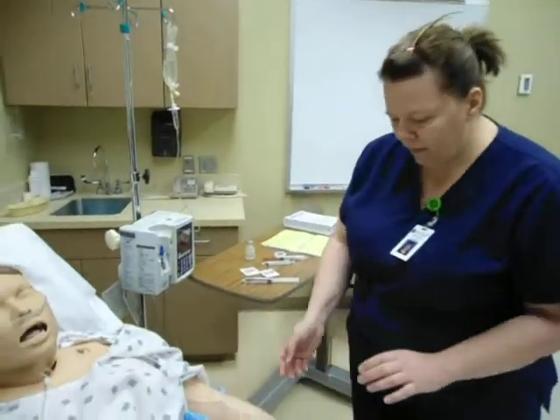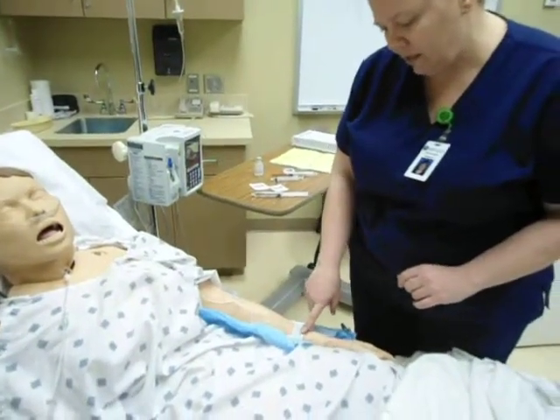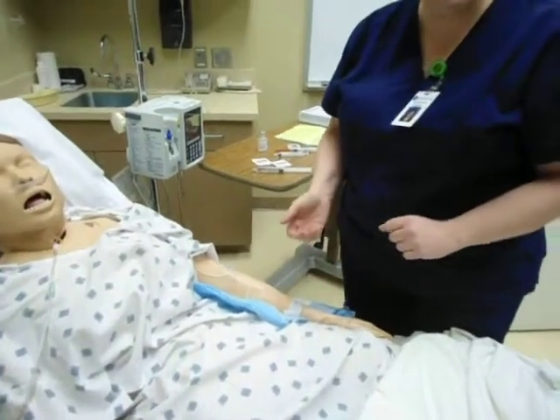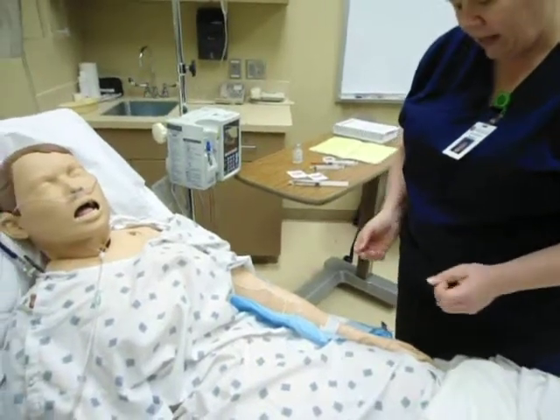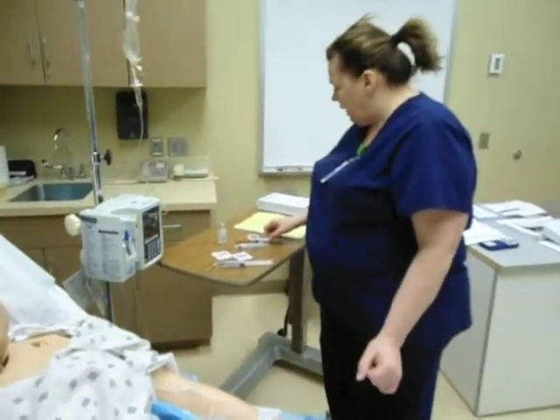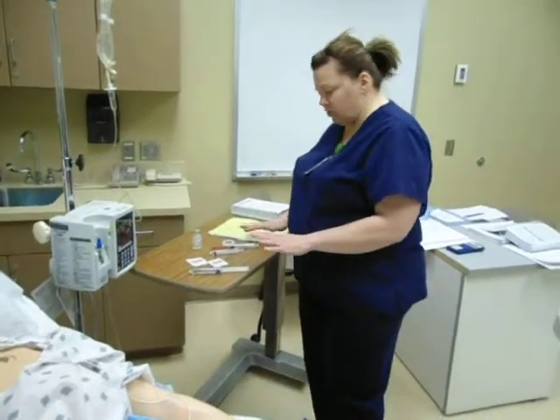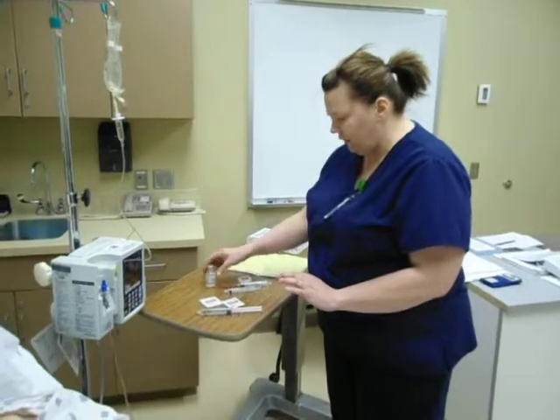I have washed my hands. I've come into the room, and I've identified my patient with 2 patient identifiers. I've looked at his wristband, and I've also asked him his birth date, which he stated back to me, and explained what I'm going to be coming in to do, that I'm going to be coming in to give him some Verapamil IV push. And now I'm going to once again go through my 5 rights just to make sure I've got everything that I need, and I have it all here.